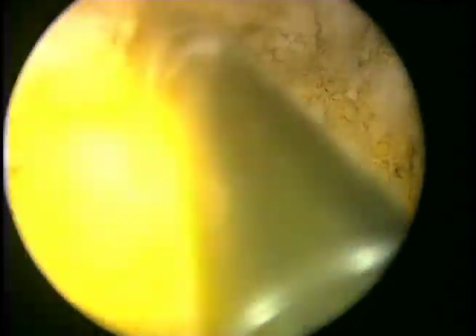and horizontal fibers of the surgical capsule. It can quite nicely be seen with a green light laser, especially once we define it, we can surf that capsular plane. So it's very important to get through the yellow, tan, brown adenoma after passing over initially, and you really carve down and make sure you see that capsule.